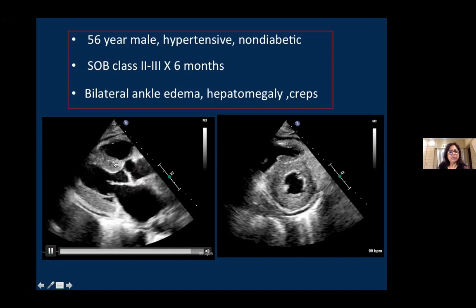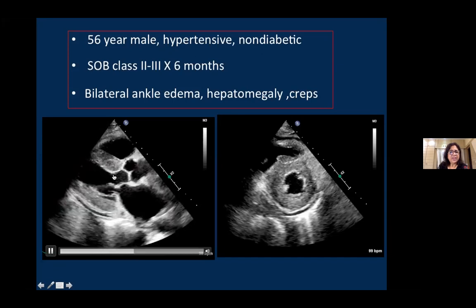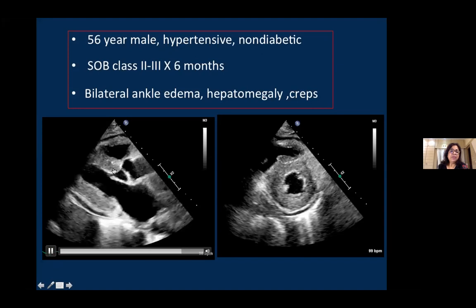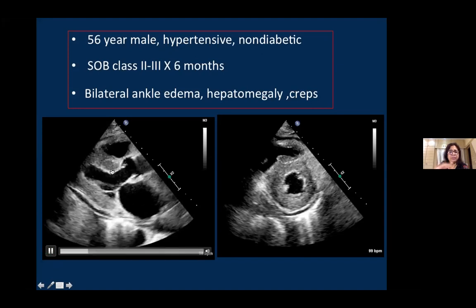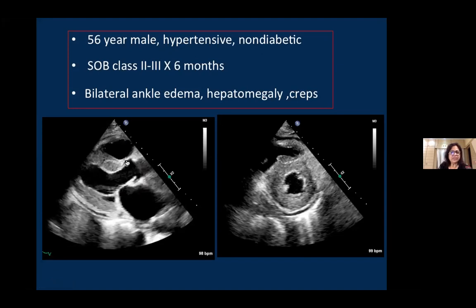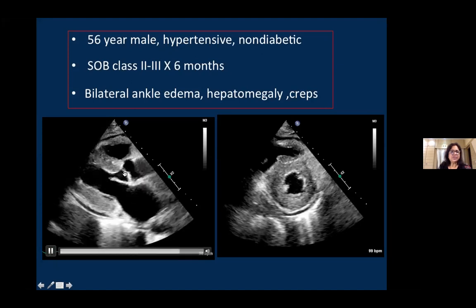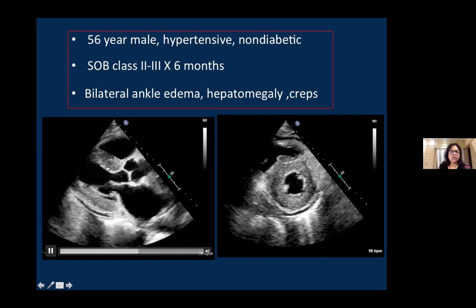Look at the septal wall thickness and posterior wall; those are increased. This is not due to hypertrophy of the myocardium, but in amyloidosis, there is a deposition of amyloid in between the myocardial layers, so that increases the thickness, and that gives rise to restriction to the left ventricle, and it makes the left ventricle non-compliant.